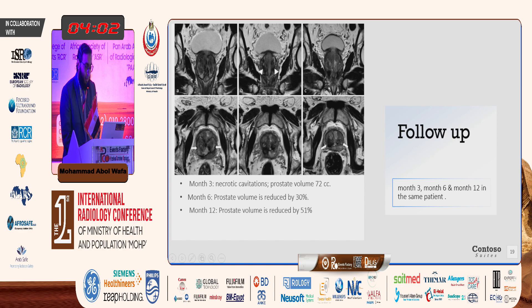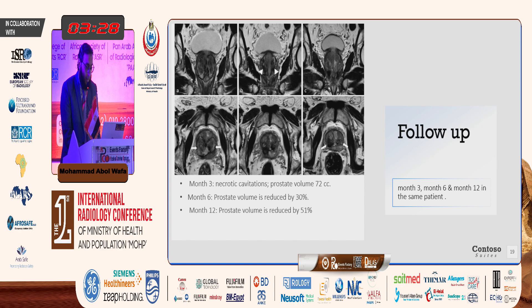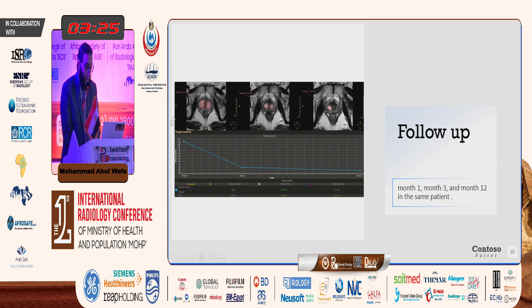Follow-up imaging was performed at three months, six months, and twelve months. On coronal and axial T2-weighted images, we can see the cavity produced by the ablation. After six months, it decreased in size. After twelve months, the prostate volume is reduced by 51% of its original size. A follow-up of the cavity is shown at one month, three months, and twelve months.